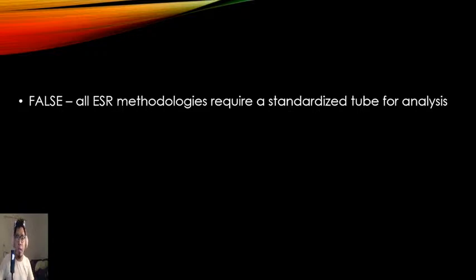You can't just use, okay, for example, Sir Marco said, okay, ito na, you can perform ESR analysis. Nagbigay lang si Sir Marco ng mga tube na mahahaba. Tapos may 100. Tapos, ito naman si Adrian, alright, sinulatan niya ng graduation na 100. Tama ba yon? Of course not. Alright? So, you gotta ask, sir, we need a standardized Westergren tube or another ESR methodology tube for this one. You can't just use this one.